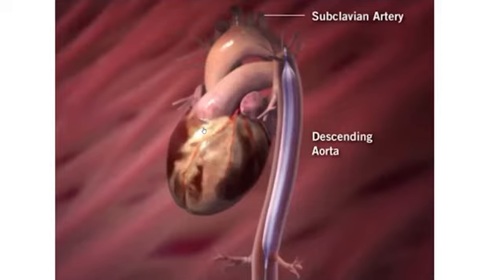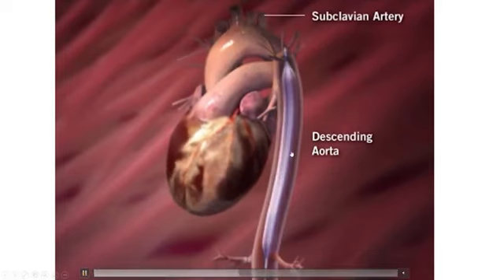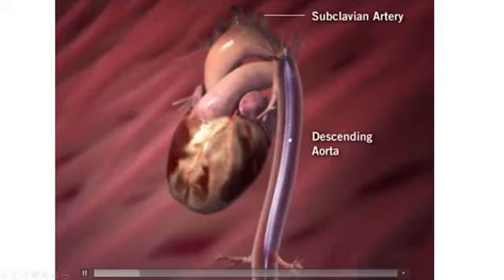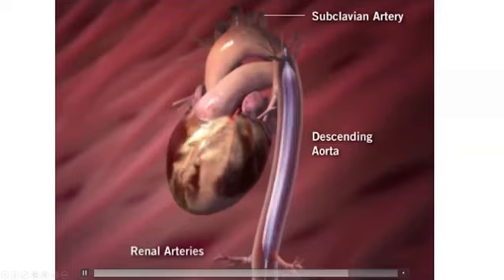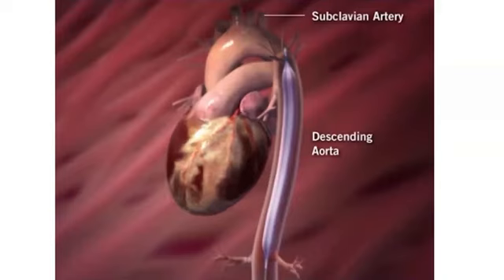So balloon pump is a balloon catheter typically placed via femoral access and positioned in the descending aorta below the left subclavian and above the renal arteries. It inflates at the beginning of diastole and deflates just at the beginning of systole during the isovolumic contraction.